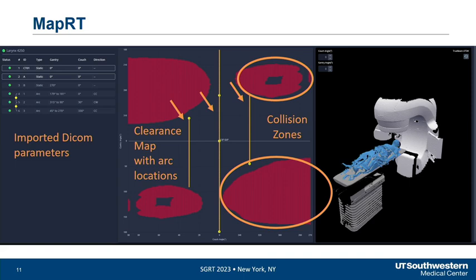There's a lot of extra space that this particular plan could use, but we are also gating off of the larynx during treatment, so we don't kick the couch too far for that reason. And lastly, you have an interactive space where you can zoom in, pan, and look at the different aspects of the capture and the treatment.